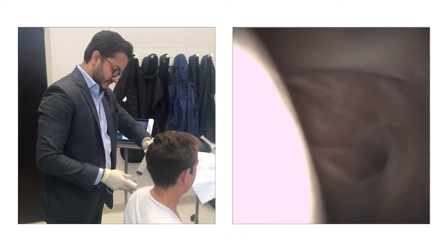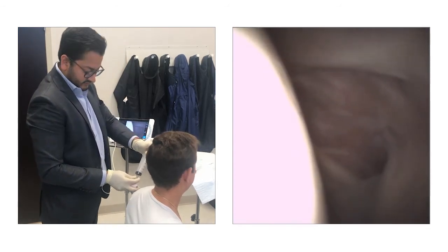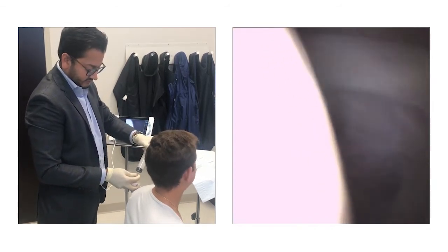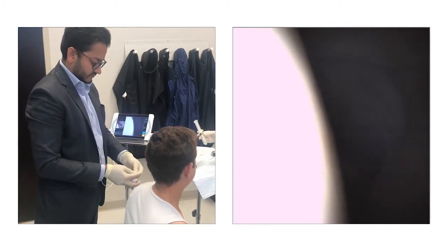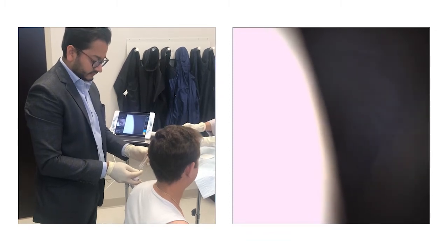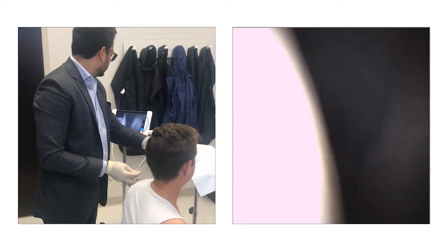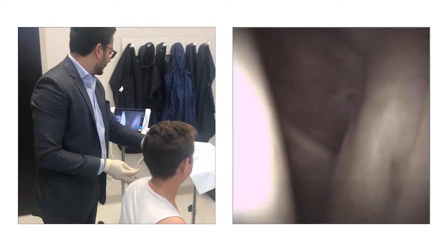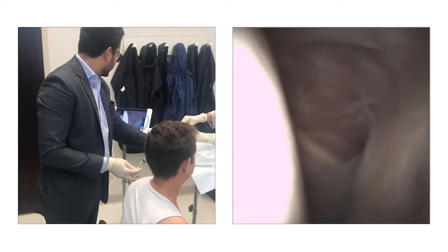How are you feeling? Okay. I can feel the pressure more in this shoulder than I did last time — okay, on the other. Keep that empty. I'm going to have to drop. Just load up the smaller one if you don't mind.